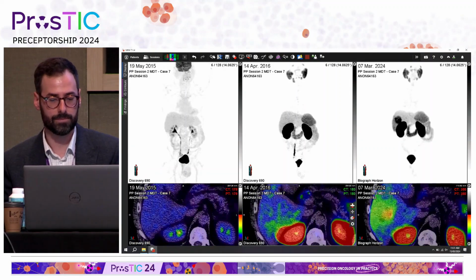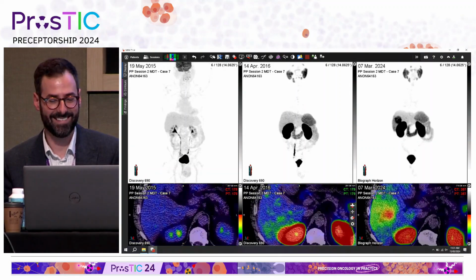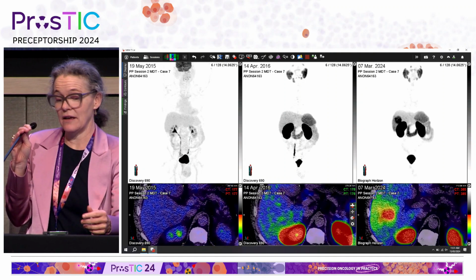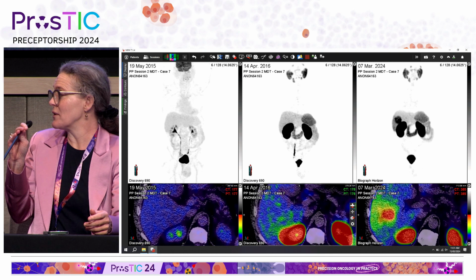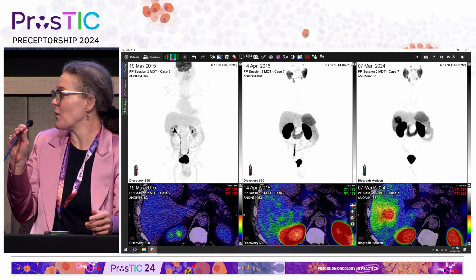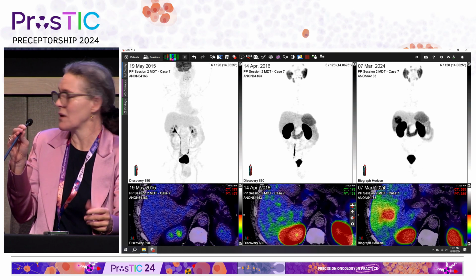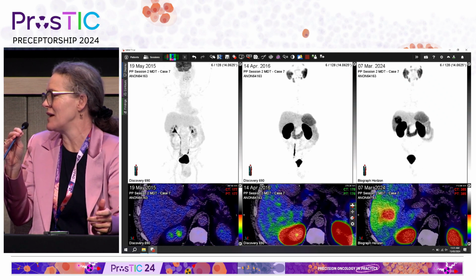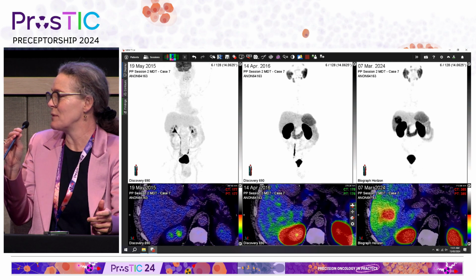Louise, do you still think it's a hydatid cyst? I think what everyone said is very reasonable. But yeah, hydatids can be quite positive on PSMA PET, and we have had cases before that have been written up. So, I'd like to know a little bit more. But obviously, another primary is going to be considered. It wouldn't likely be prostate cancer.